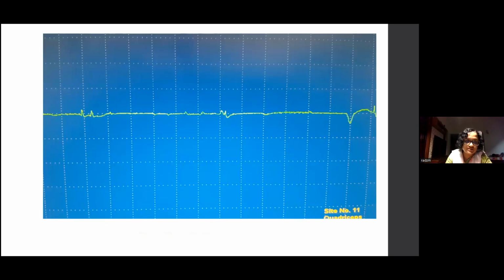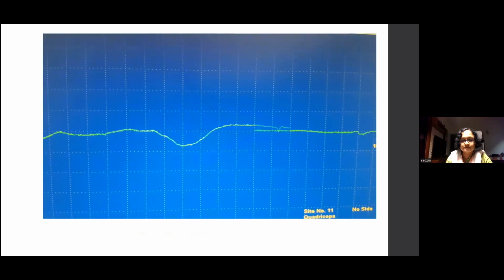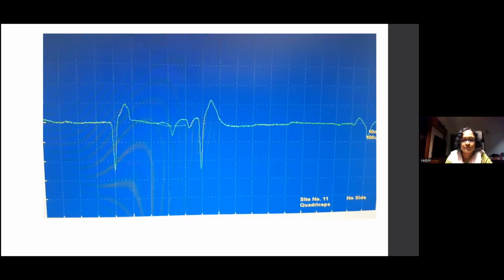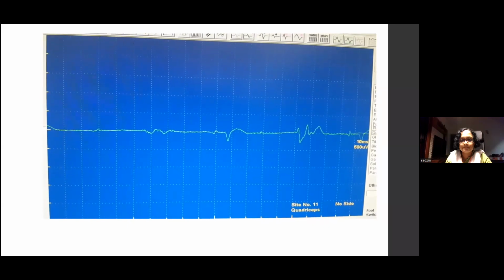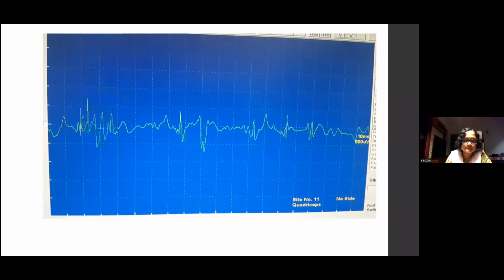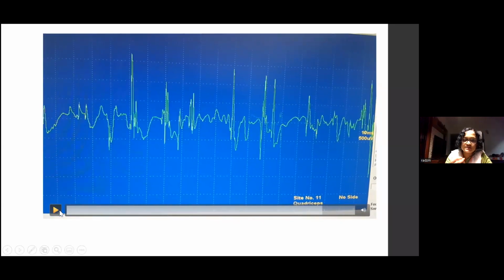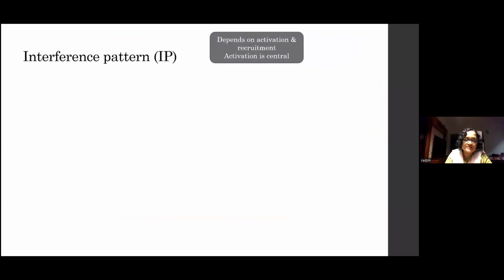which you see in inflammatory myopathy, for example, or any myopathy where there is myonecrosis as well. So you can see the positive sharp waves. That's voluntary activity, but you can see the positive sharp waves in between. So when the instruction is given to contract, there's a quick contraction and multiple motor units come into play. So that's early recruitment. The last one is the interference pattern.